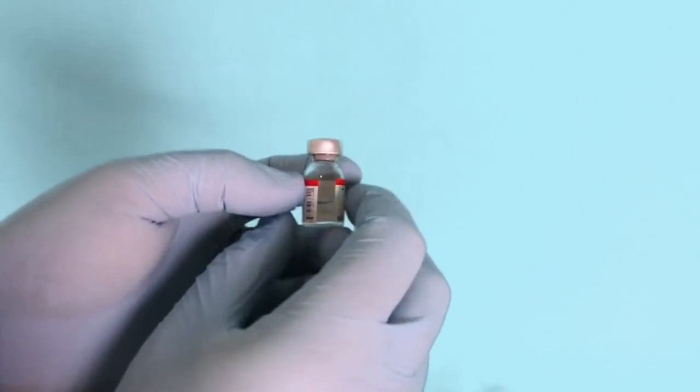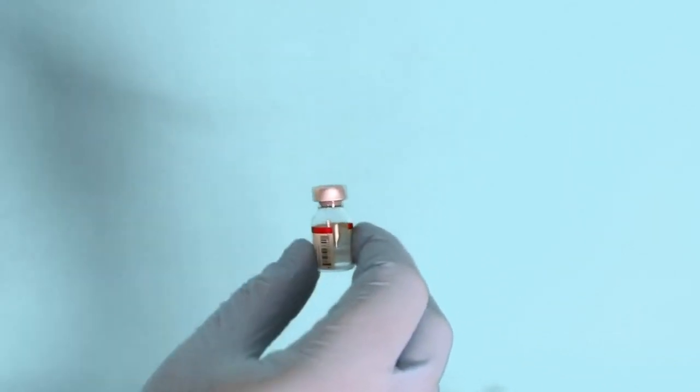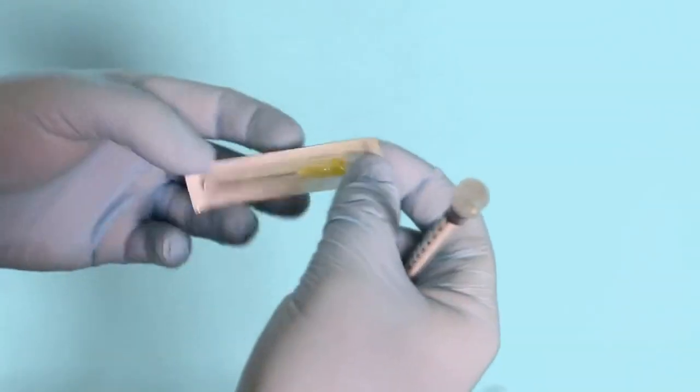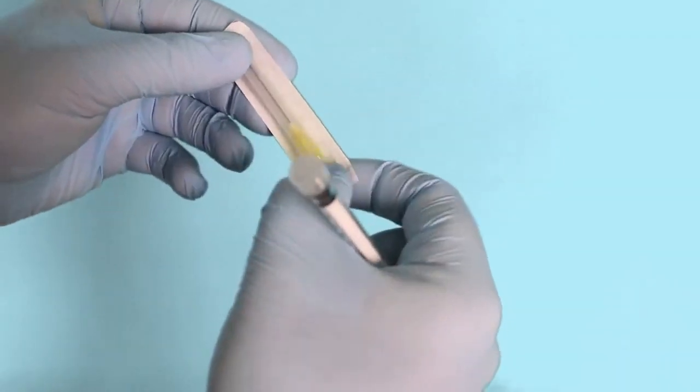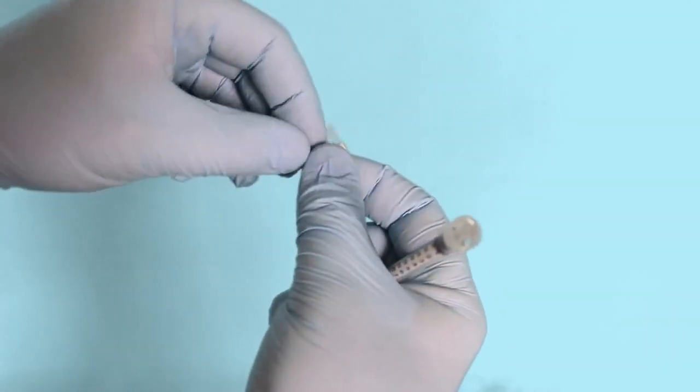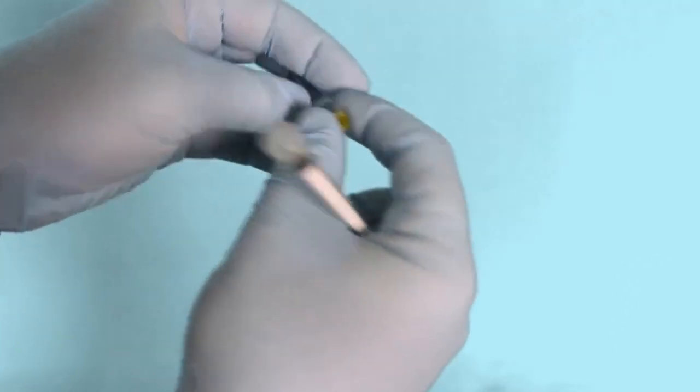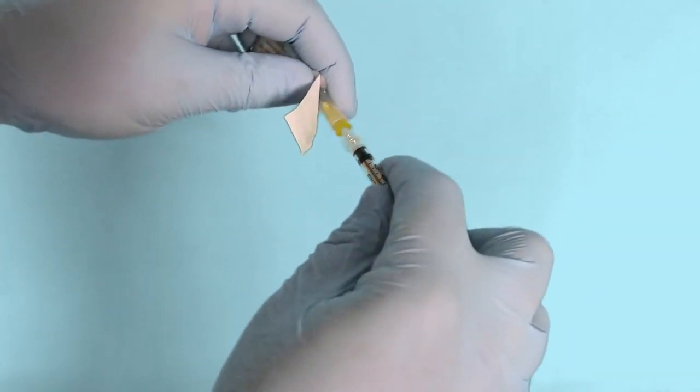Secondly, in order to remove fluid from a vial, we first need to inject an equal volume of air into that vial as the amount of fluid we wish to withdraw. This compensates for negative air pressure that would be created by attempting to remove fluid.